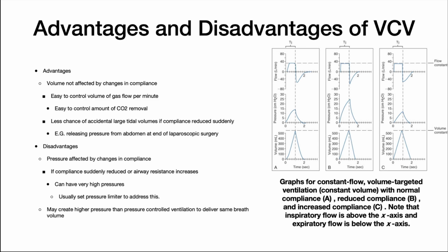The primary advantage of volume-controlled ventilation is that it guarantees a specific volume delivery and volume of expired gas, regardless of changes in lung compliance and resistance or patient effort. The goal of volume-controlled ventilation is to maintain a certain level of PaCO2. Because we're delivering a set volume, there's also less chance of hypoventilation. The main disadvantage of volume-controlled ventilation is seen when the lung condition begins to worsen, and this can cause the peak alveolar pressures to rise, leading to alveolar overdistension.